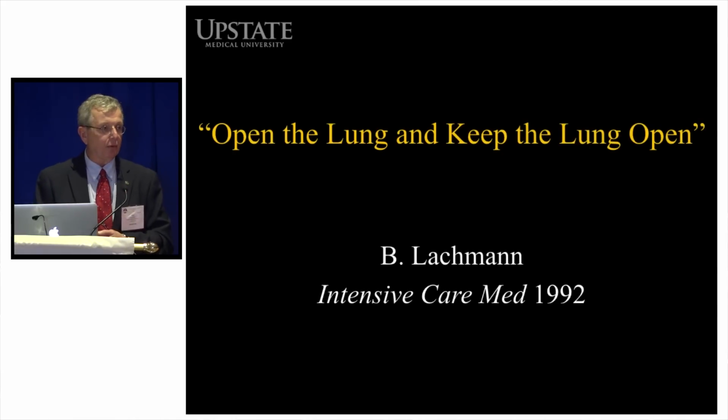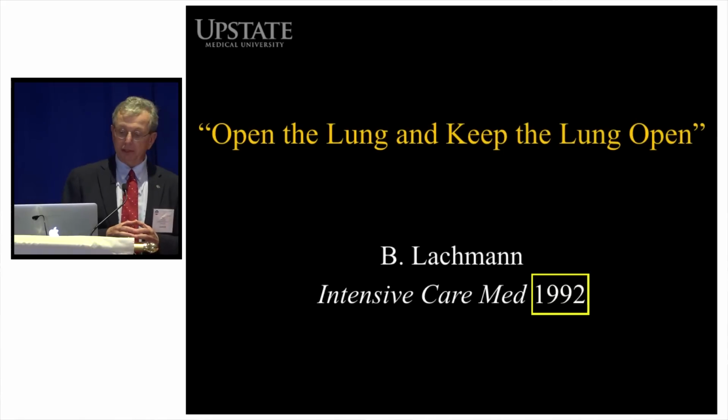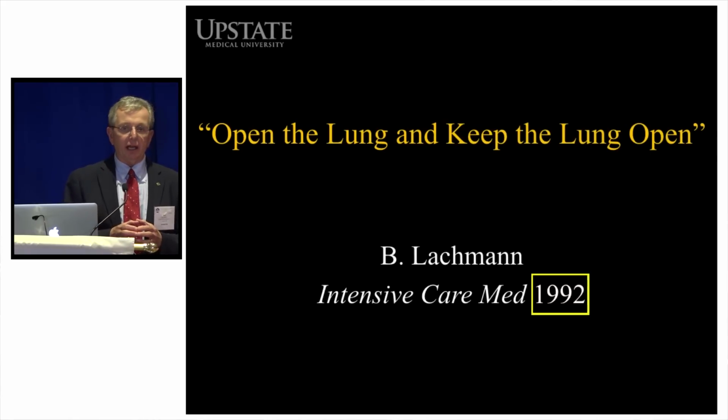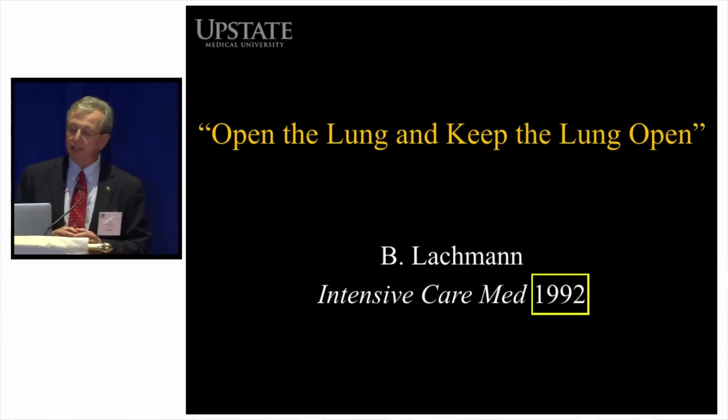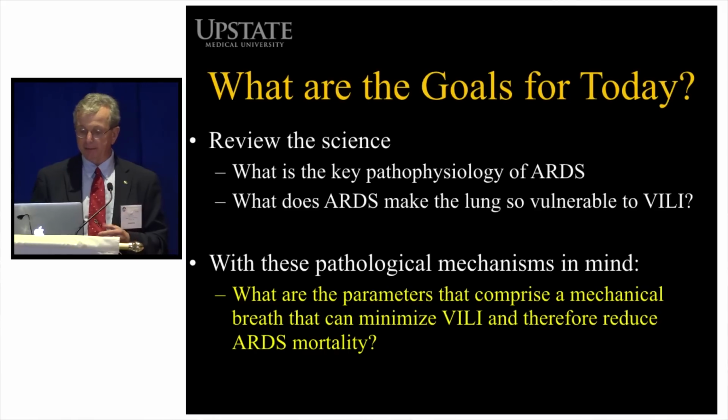And guess what? We're not the first ones to say that. Way back in 1992, Dr. Burkhard Lachmann had a famous paper and a quote just saying, open the lung and keep it open. And all of our physiologic work for the last few years tends to support Dr. Lachmann's hypothesis that was actually generated in 1992. So we're starting to give a lot of very solid physiologic evidence that indeed, if we open the lung and keep it open, it's going to be greatly protective.